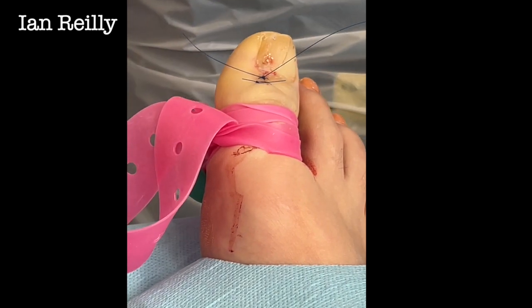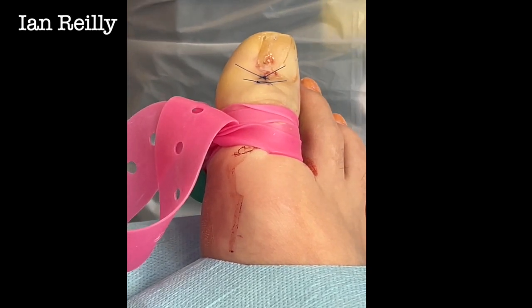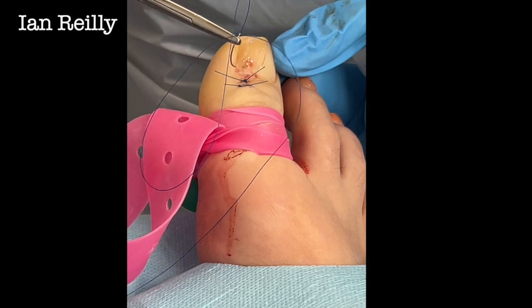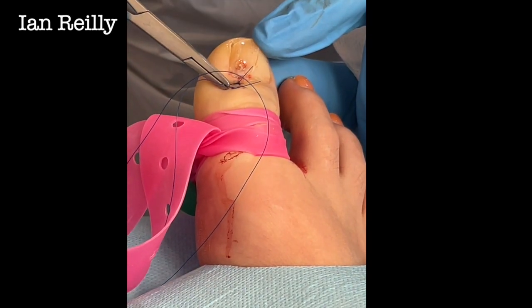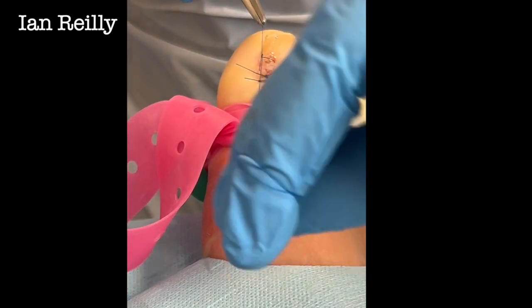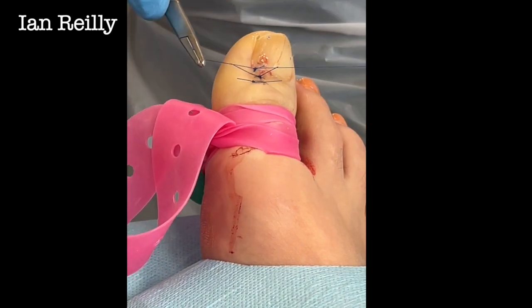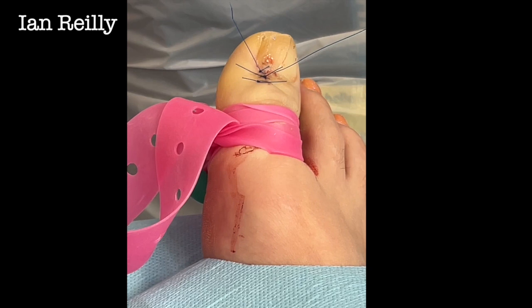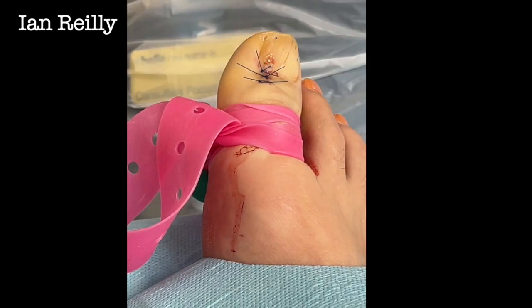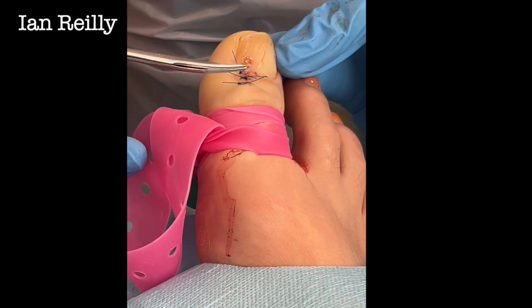We're going to leave these stitches in about a week and get this young lady in. I'm just going to tack that bit in to the underside of the nail so there's no dead space — I've just gone through the nail there. It doesn't need any kind of fancy dressing on that; I'm just going to put a little dressing on to hold the stitches in for about a week. Then we'll do a three-month follow-up to see how that nail is regrowing.